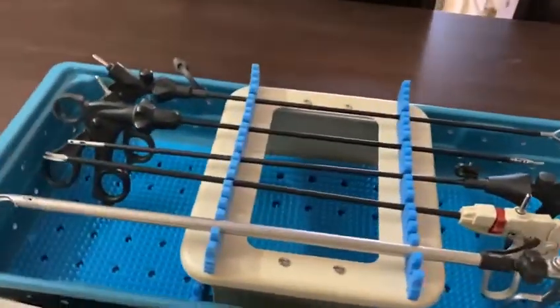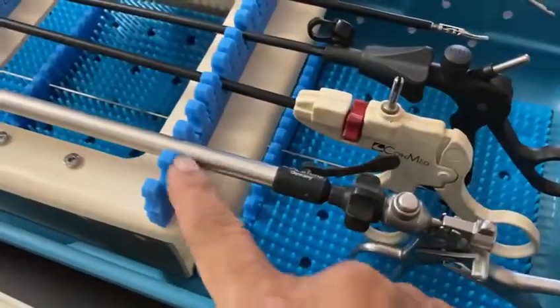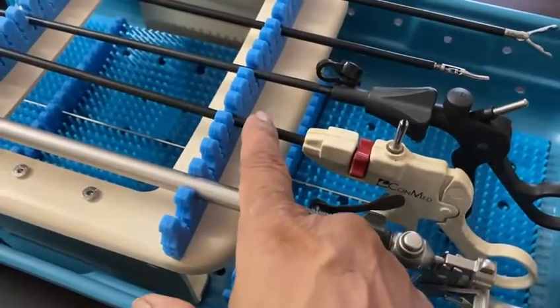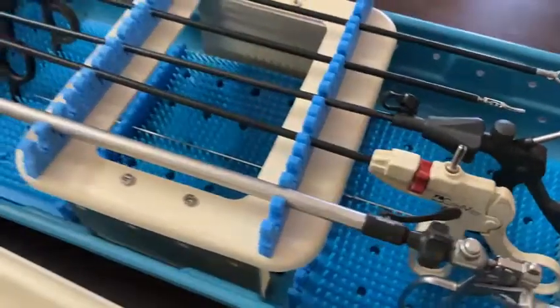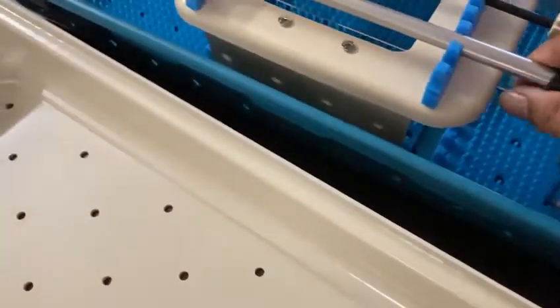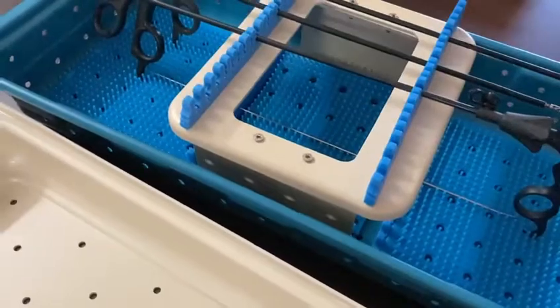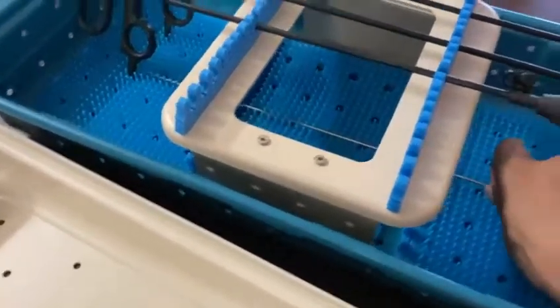You have the provision of keeping laparoscopy instruments — both 10mm and 5mm. And you can also keep the instruments in the bottom, like this.